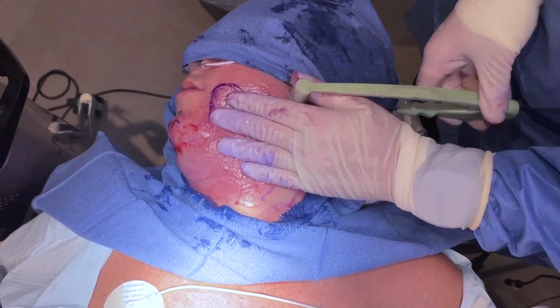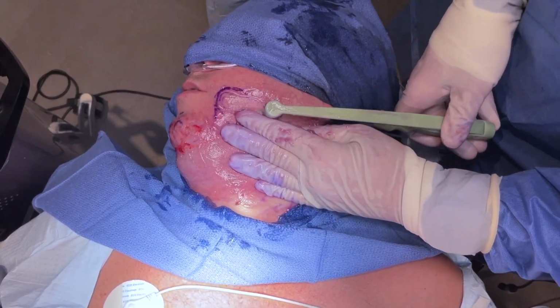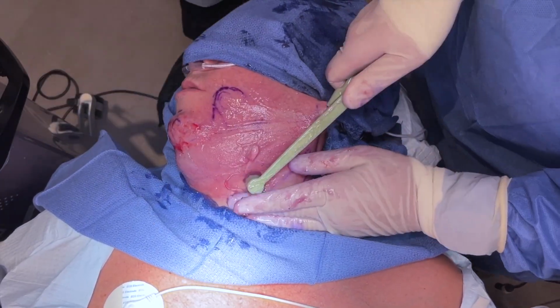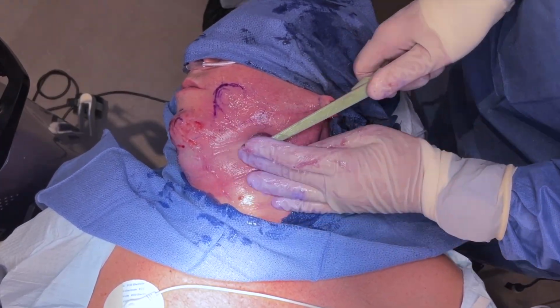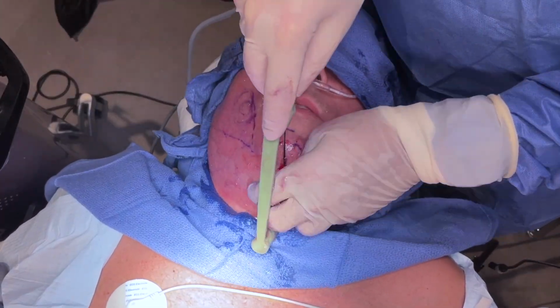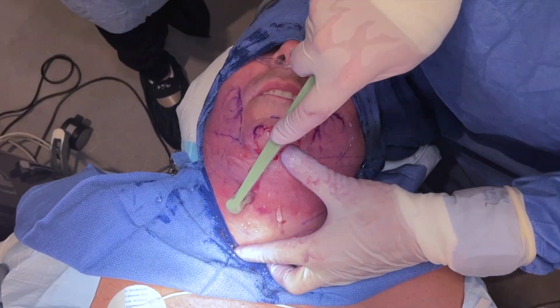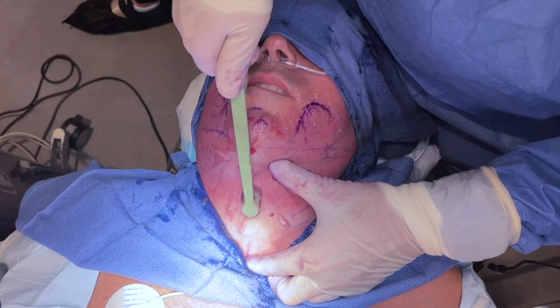And then the neck is divided into 3 zones. So the lateral areas that I just did, and then the central zone that we're doing right now. And each of these zones is supposed to get a certain amount of energy. We usually like to get at least between 4 to 5 kilojoules in each zone of the face. Of course, it also depends on how heavy a neck someone has, how much laxity they have, male or female, but typically 4 for each side of the neck. So the 2 lateral sides and the midline, so 12 total is a good number to remember.